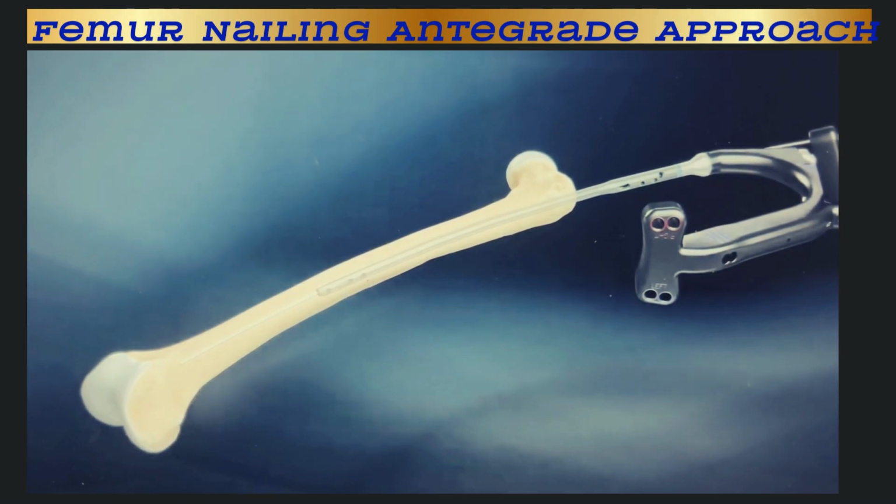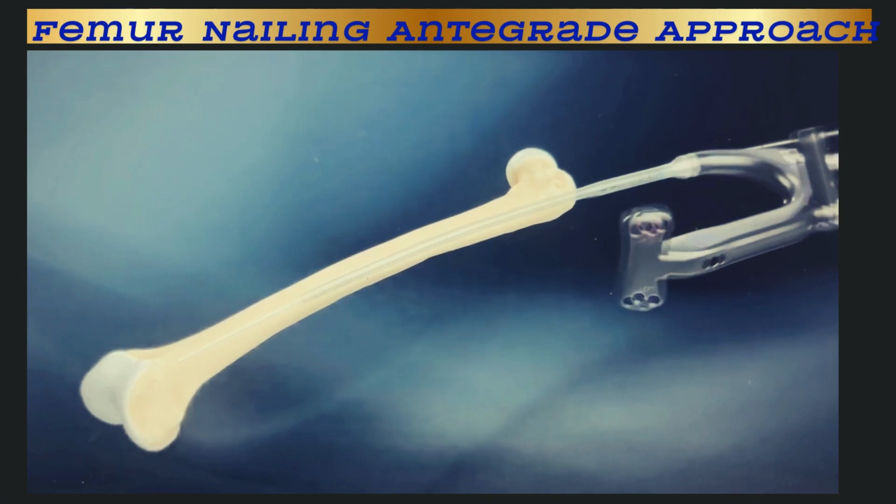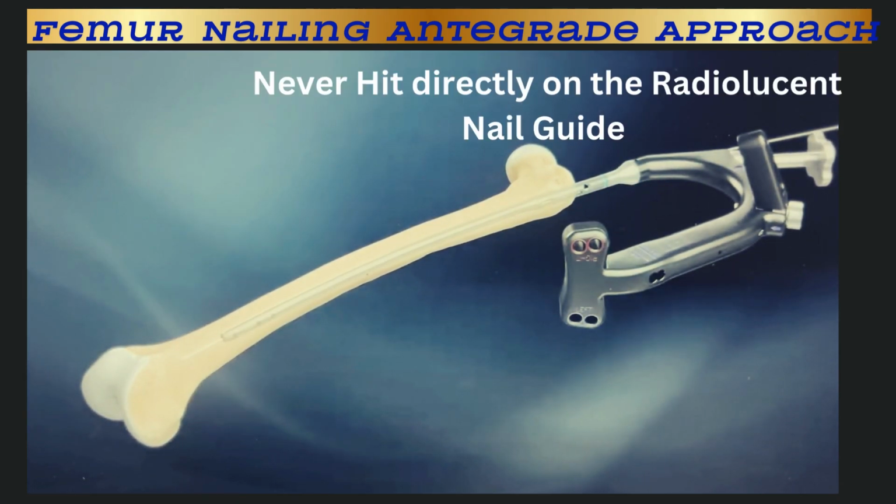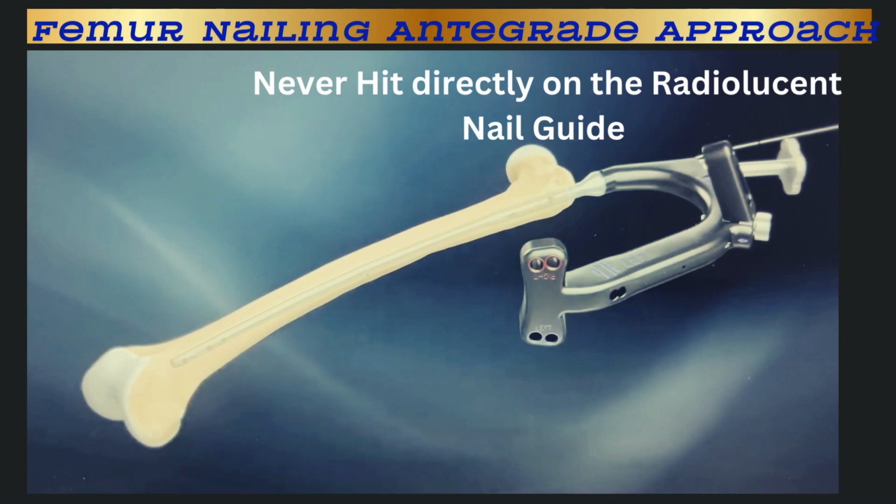If the nail does not enter the femur easily, use a mallet to apply a gentle blow to the impactor pad. It is very important to never hit directly on the radiolucent targeting guide.